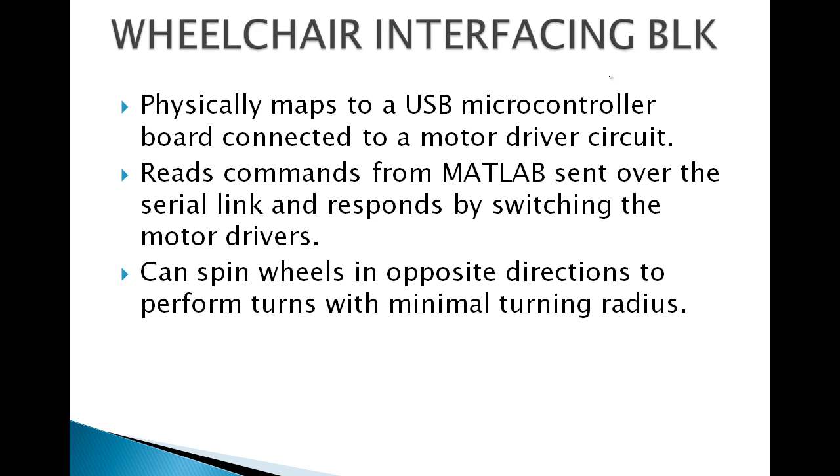And the wheelchair interfacing block, as mentioned, consists of a USB microcontroller board which runs some firmware and is connected to a motor driver circuit. Depending on the commands being sent by MATLAB, the motor drivers can be switched and the wheels can be spun to obey these commands. For example, to turn left or right, the wheels can be spun in opposing directions.